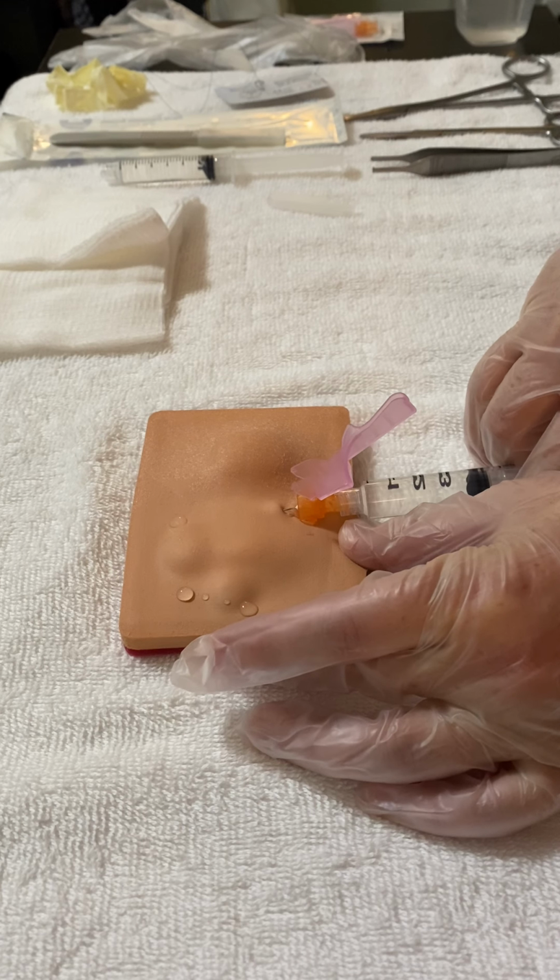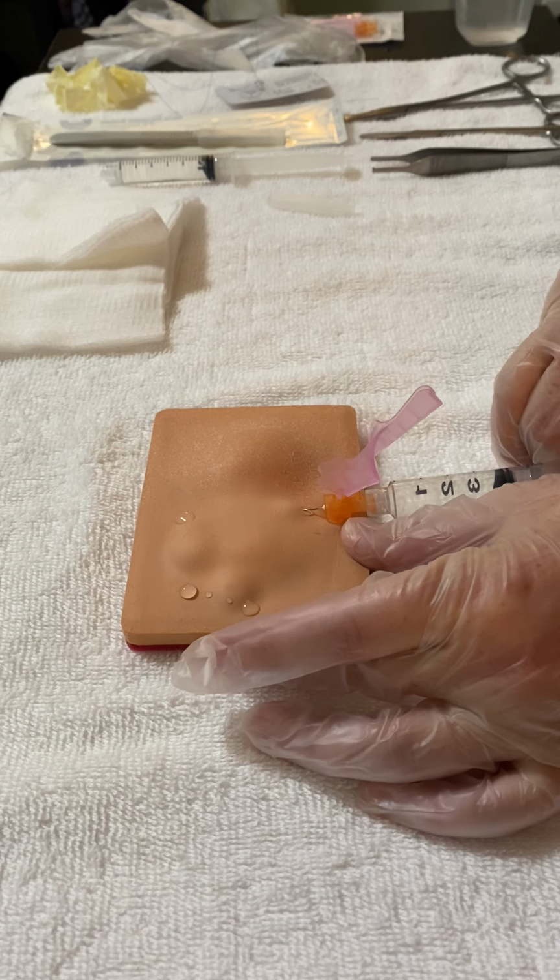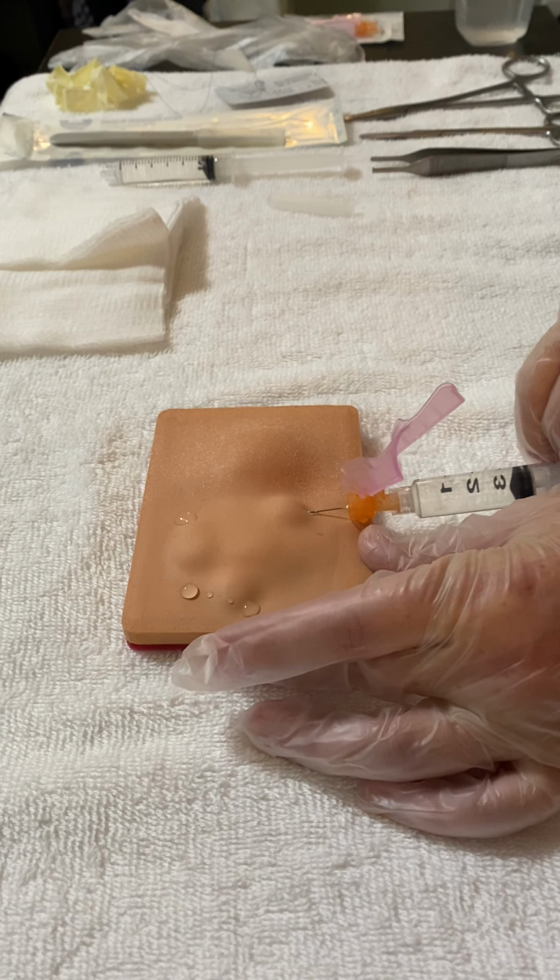And in performing a field block, I would attempt to anesthetize the entire circumference of the cyst.